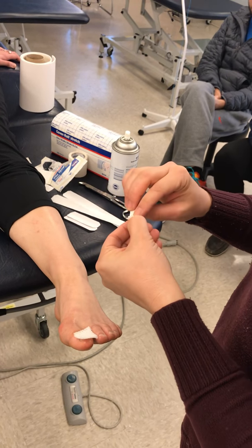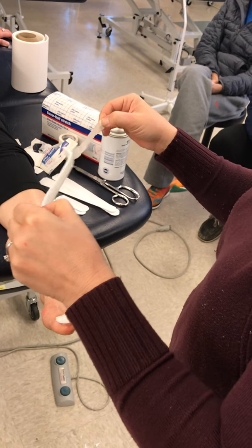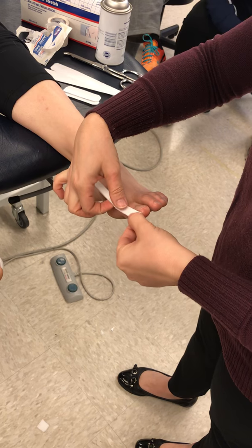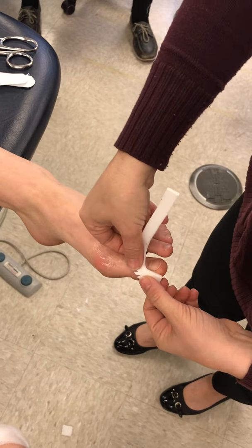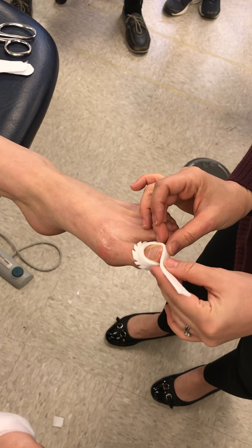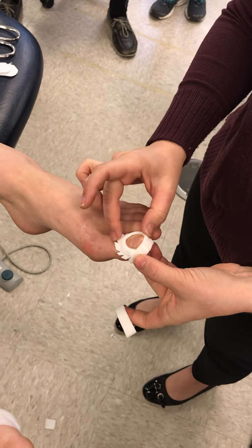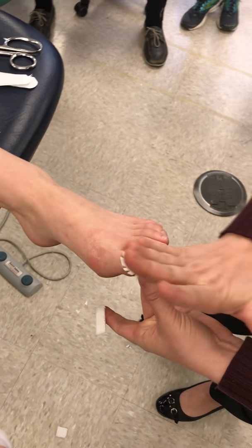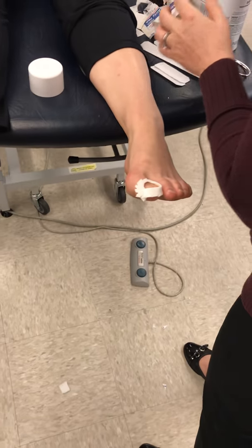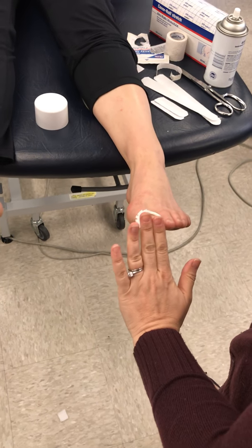Then what we're going to do is peel that back — sometimes it doesn't peel perfectly. So we're going to take that piece and go around her nail bed. I've got to make sure that's okay — she tells me no problem. And then I'm going to finish this bumper on top, because what's going to happen now is her shoe is going to touch all of this. When she's in her shoe, the shoe will hit the bumper and not her nail bed. That's why we call it a bumper. So we've got a donut, but the concept of the donut now is not just to delineate an area — it's to create a bumpering mechanism.